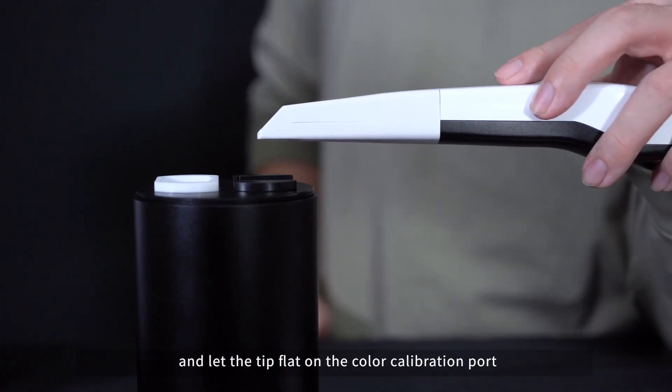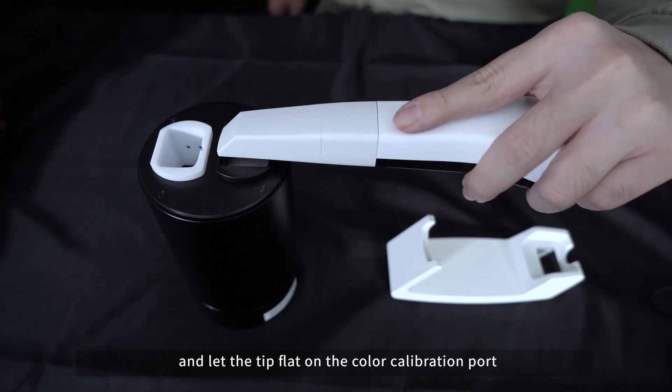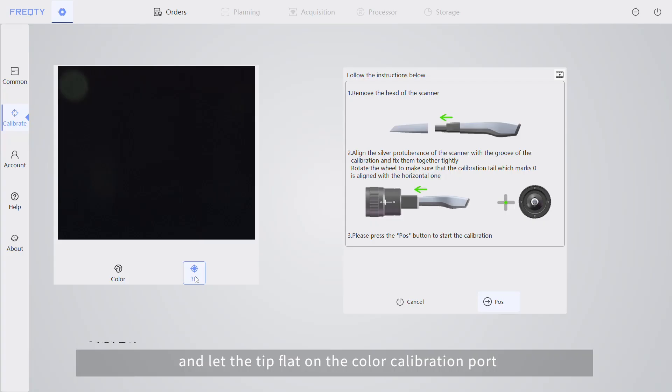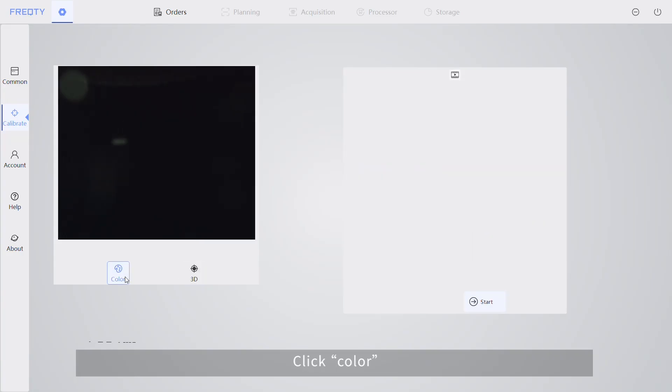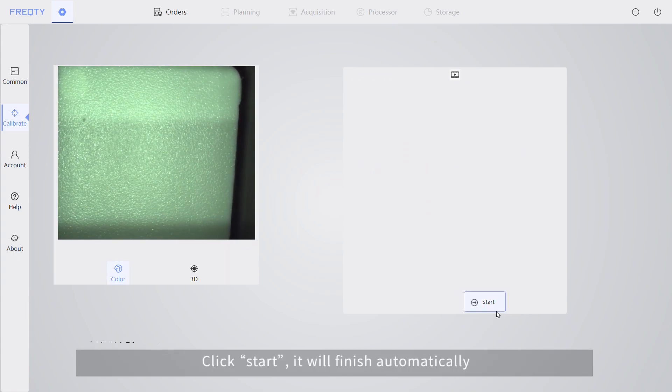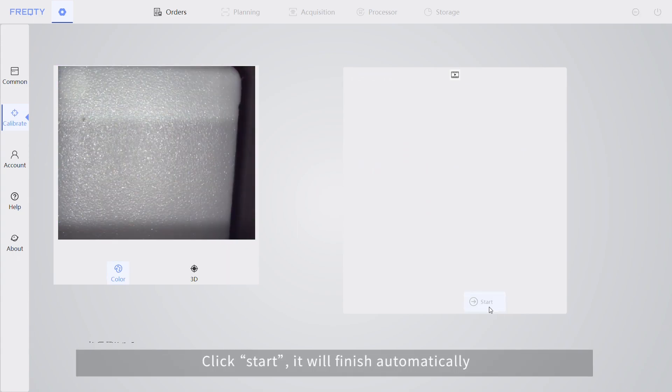Then insert the tape and let the tip flat on the color calibration port. Click color, then click start. It will finish automatically.